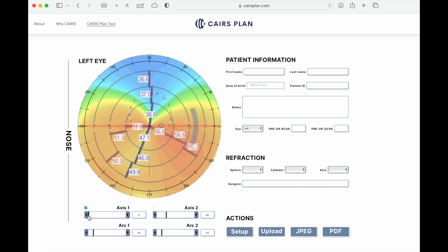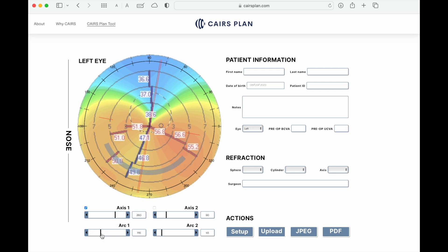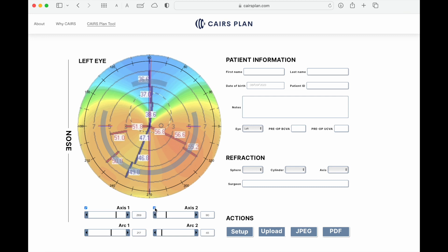By default, only one segment will be visible for your planning. However, if you want to insert two ring segments, simply tick the checkbox above axis 2 and the parameters for your second ring segment can be entered. Segment size can range from 1 degree to 355 degrees. You can manipulate the length and axis of your segments by either using the integrated sliders or manually entering the central axis and length of your arc or arcs in degrees.